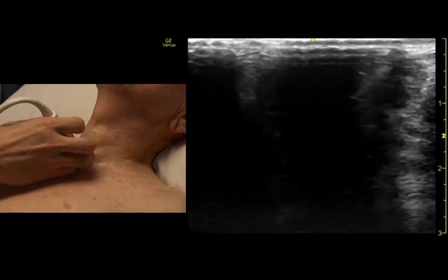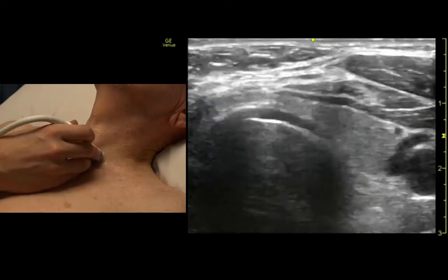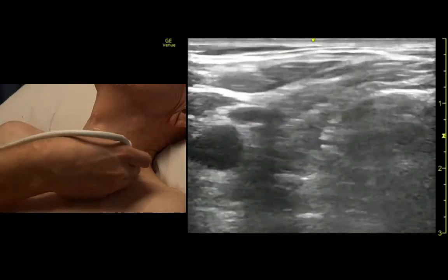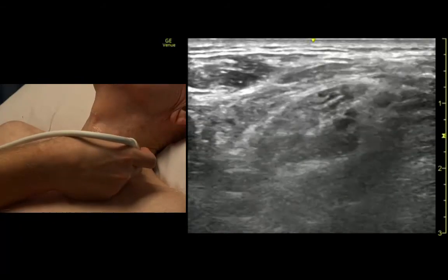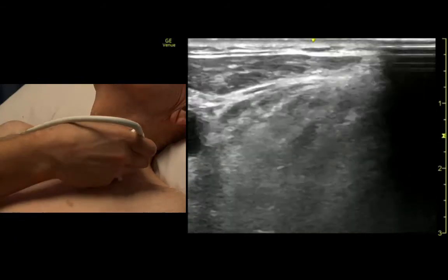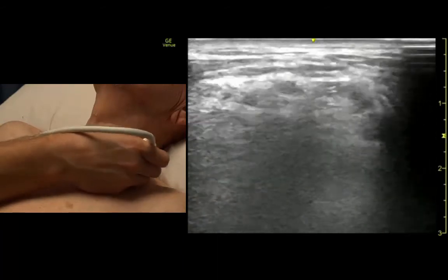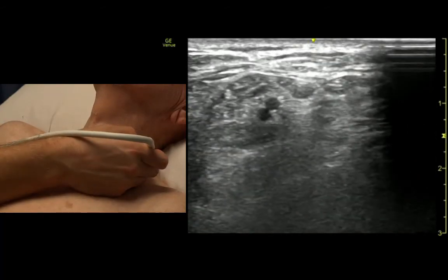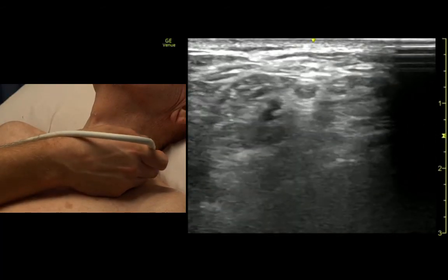We can do that on this side as well. Here's the carotid — come back and up a little — and there's the interscalene groove right there.